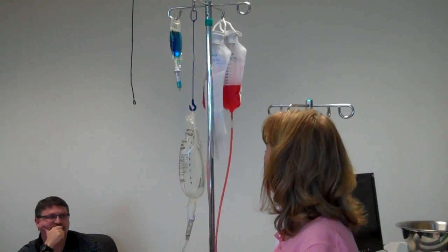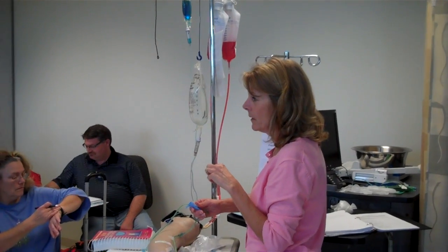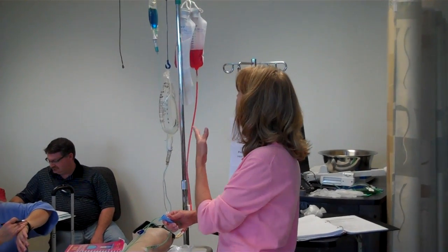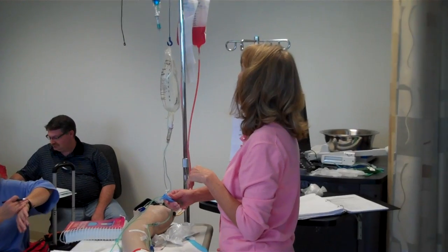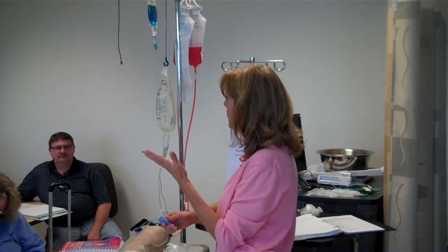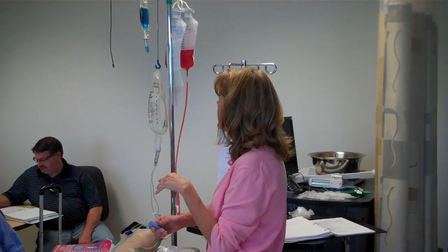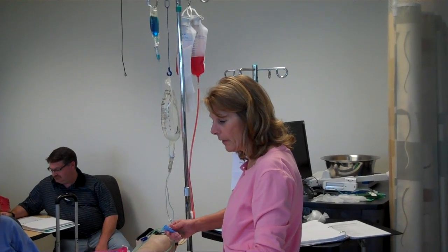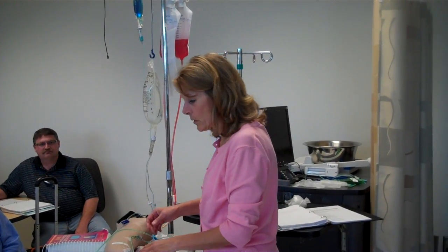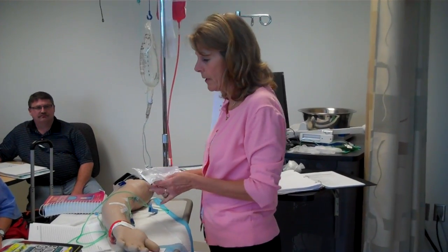According to the checklist on 19, it says we can be within 5. So let's say I count it and you've got it at 46. You're okay, because you can go 5 above or below. If the rate is 50 drops per minute, anywhere between 45 and 55, we accept that. Okay, we're running, it looks good. Alright, Mr. Jones, how's that feeling for you? Okay, it doesn't burn, it feels okay for him.